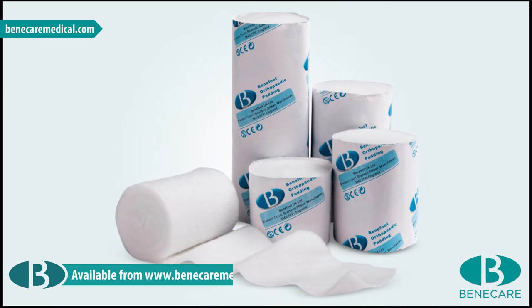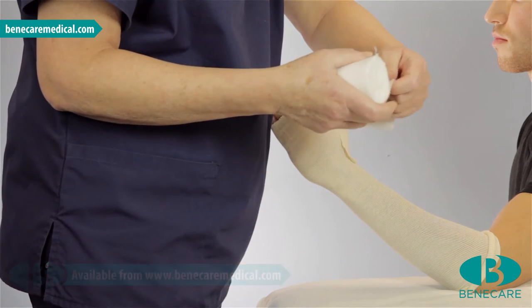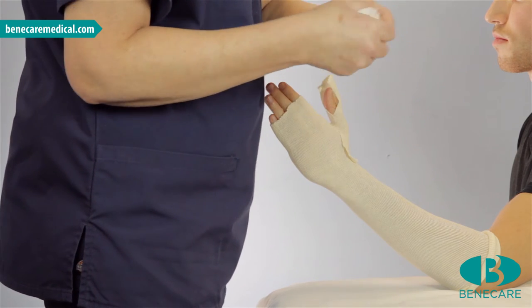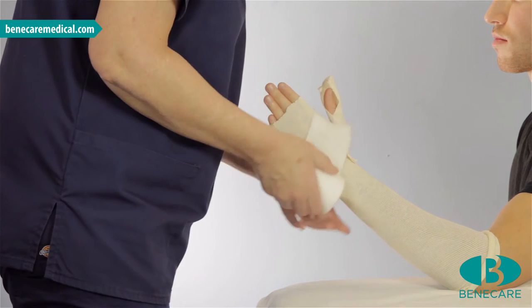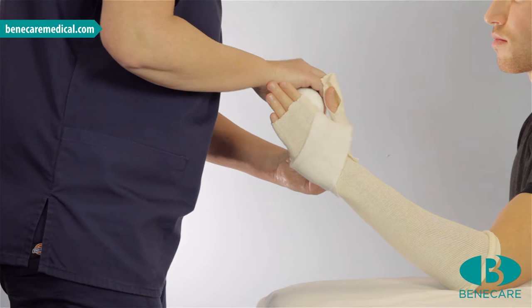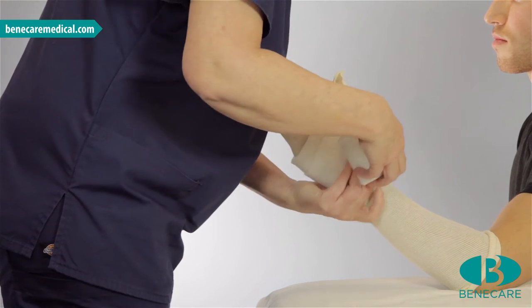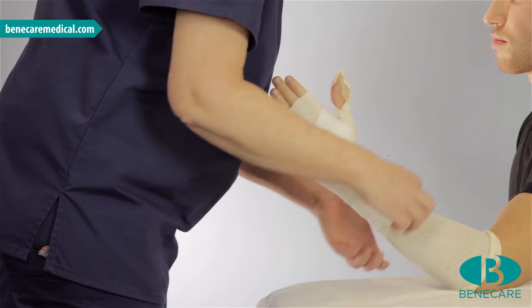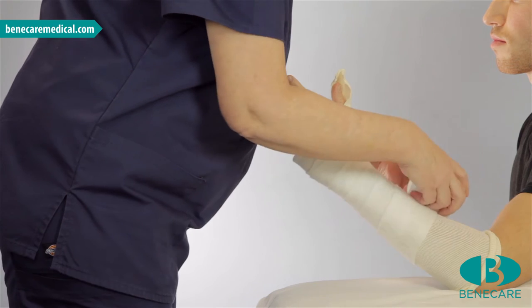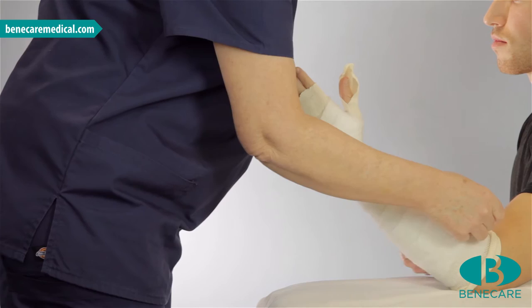Now using Benecast synthetic undercast padding, 7.5cm, at approximately 7cm from the end of the roll, make a small tear. Position this in the web space of the hand and continue around the hand. Then make a second tear to fit into the web space. Now continue around the hand capturing the ends and then work down the limb covering 50% of the previous turn. This will provide a double even layer, which is the foundation of the cast.